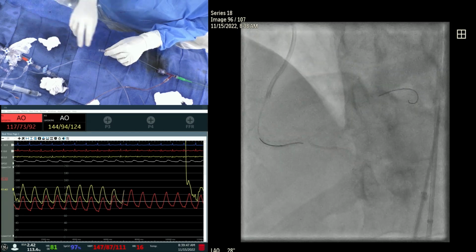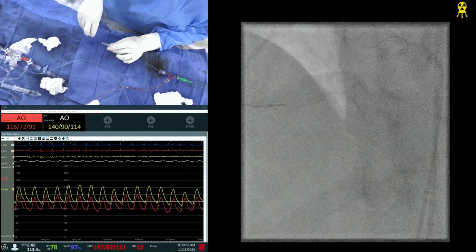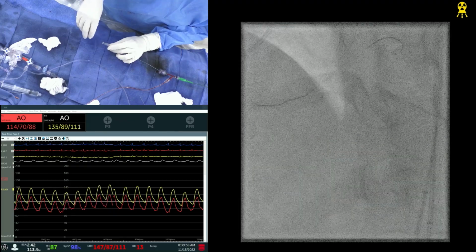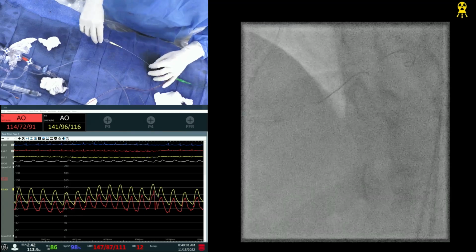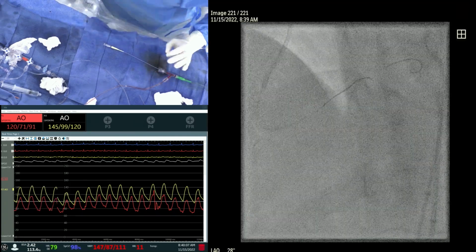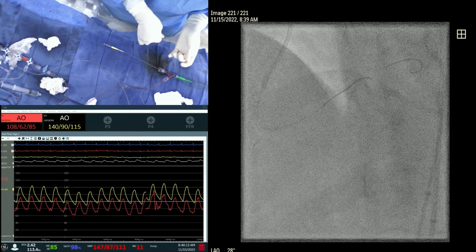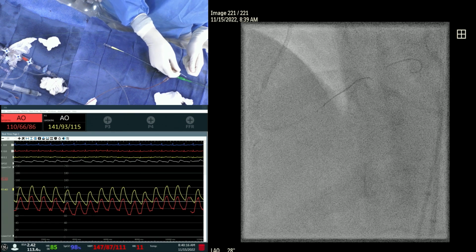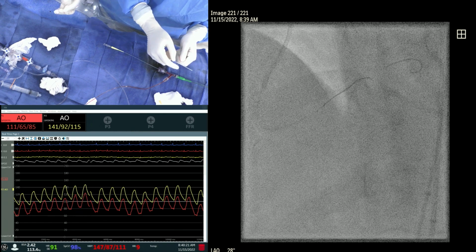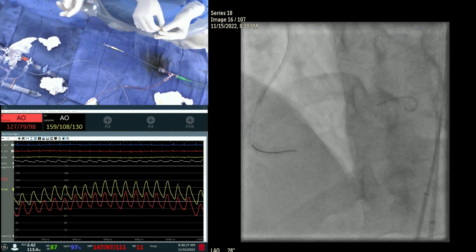This is asking for a Miracle. That's the Fine Cross. So we can do Miracle, it is there. Other thing is, a very angulated PDA now. As you saw, it was there and that way anyway. Good. Got the Miracle. Make a reshaping. So Miracle 6 we had, but keep a Whisper also nearby. Okay. So see that angle by the retrograde injection.